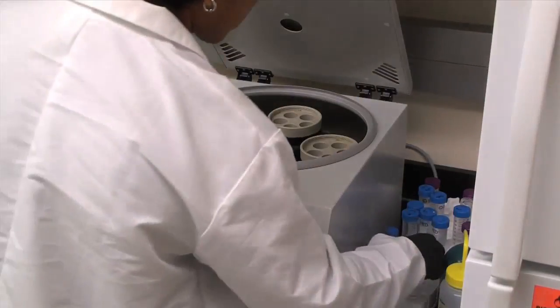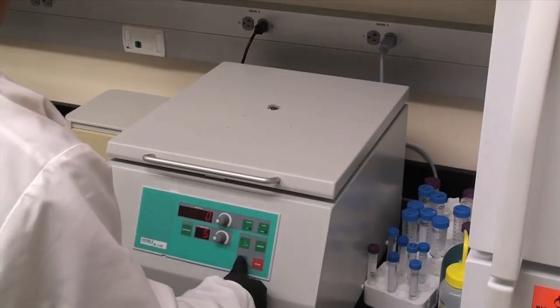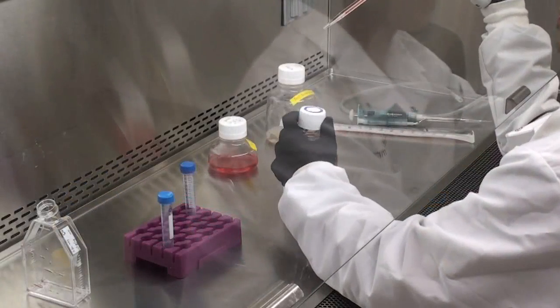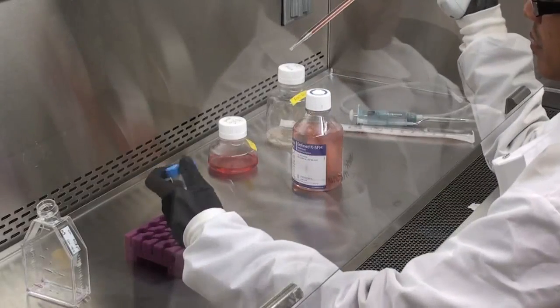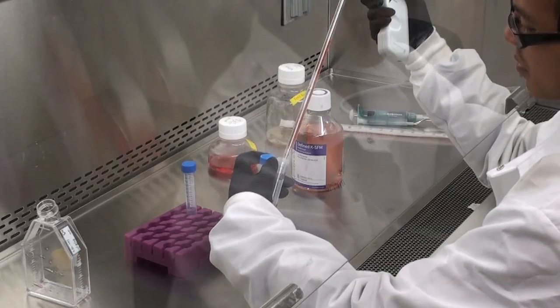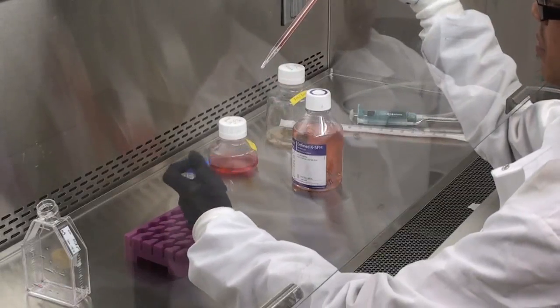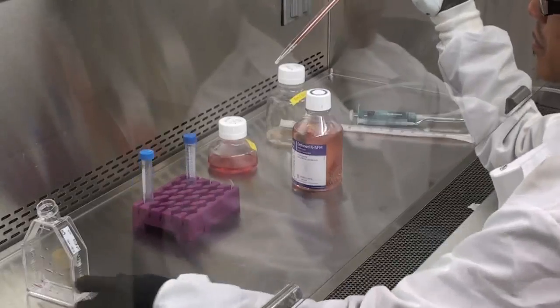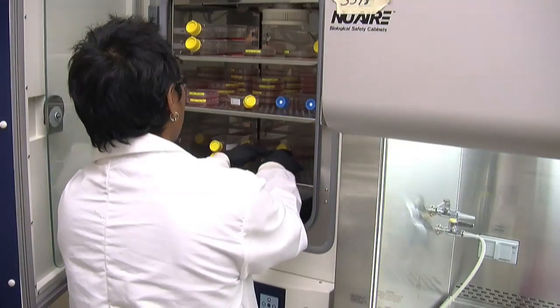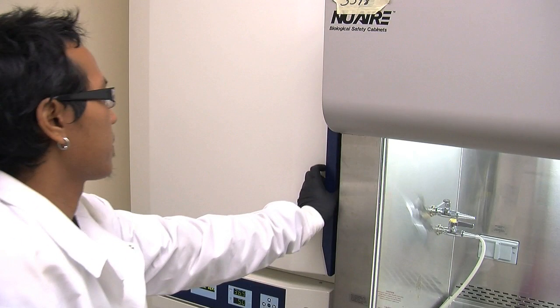After the cell count, pellet the cells down to the bottom of the tube by centrifugation. Make sure to balance the centrifuge. The usual rotational velocity is in the range of 500-1000 rpm and lasts for 5 minutes. Based on the perceived density and hemocytometer count of the cells, a fraction of the cells are dispensed back into the flask. Once dispensed, fresh media is added to the culture flask and placed back into the incubator. Make sure that the incubator temperature and percentage of CO2 is set correctly, normally 37°C and 5%, and that the door is shut properly.